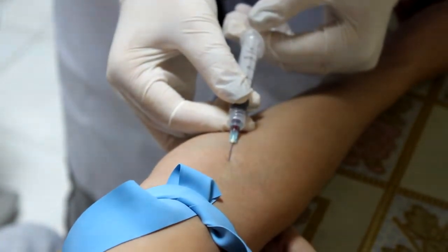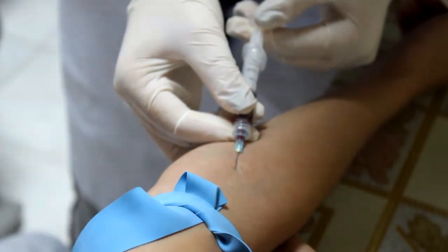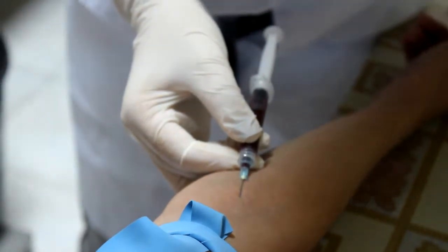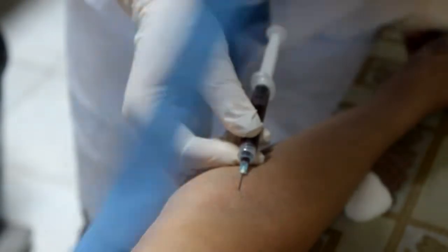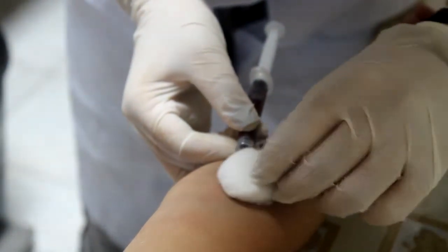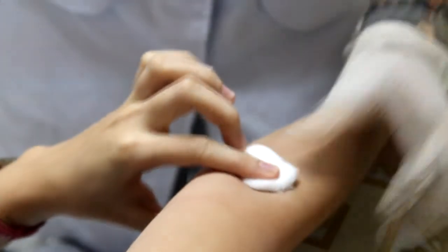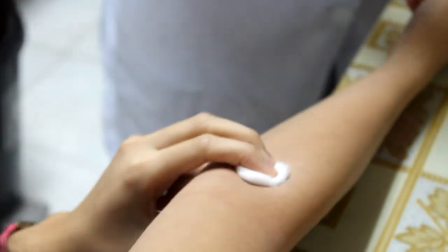Draw the desired amount of blood by slowly pulling back on the plunger. When enough blood has been obtained, have the patient open his fist. Release the tourniquet. Place a gauze pad or a cotton over the puncture site and quickly remove the needle. Immediately apply pressure. Ask the patient to apply pressure to the cotton for at least 2 minutes.